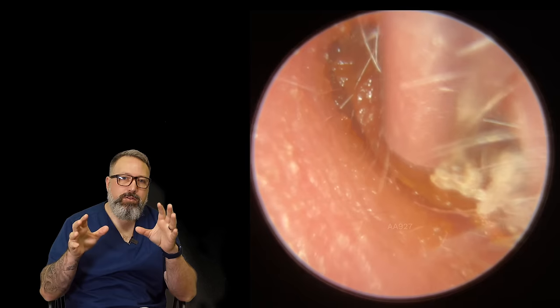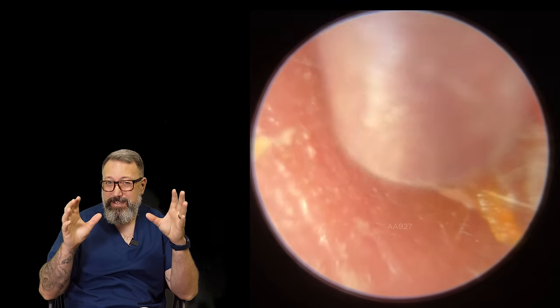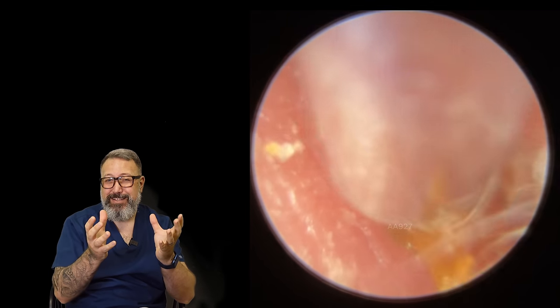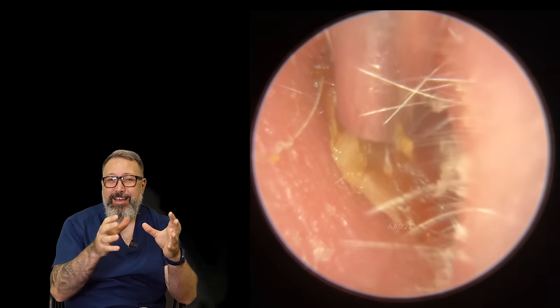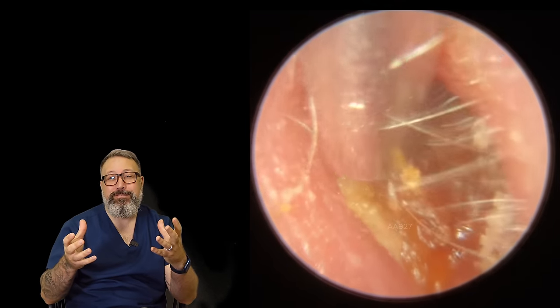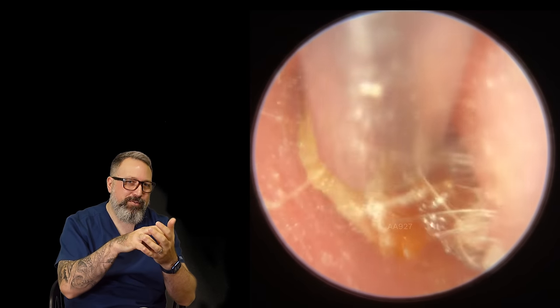So what he's got here looks like a very, very hard piece of wax. Difficult this one, because it looks like a hard piece of wax that's almost perfectly formed to the same size, or even slightly bigger than the entrance to the canal. He's got a bit of a double whammy to deal with here, because when you get these hard surface pieces of earwax, it's very difficult to get a fantastic suction grip on them.